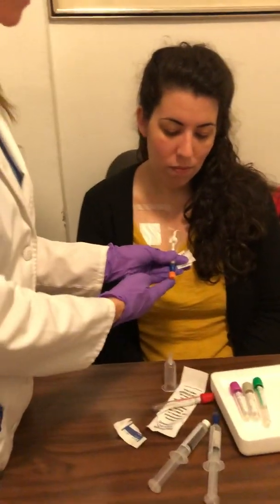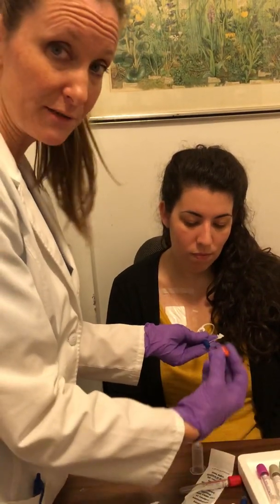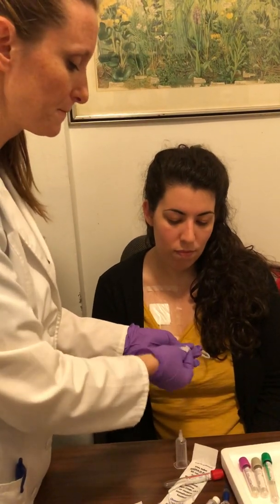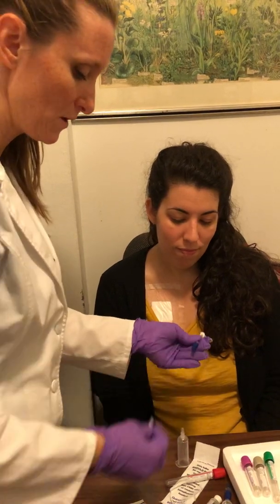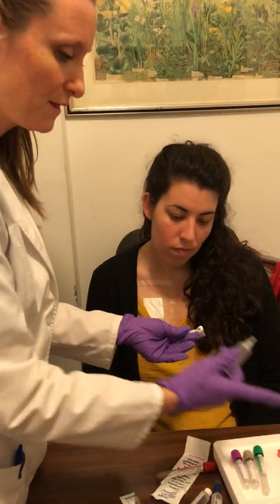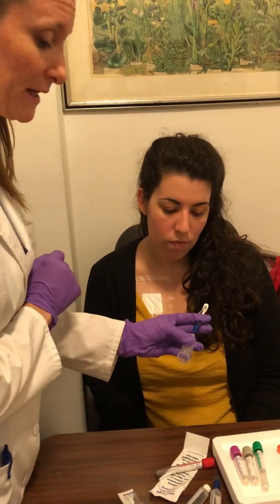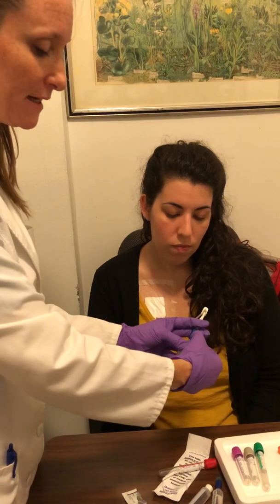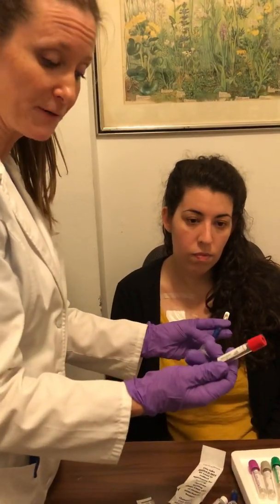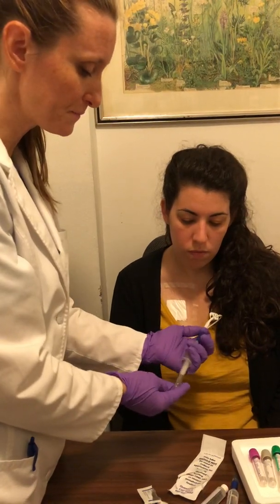Wipe the end of the tube with alcohol. She has a cap covering the end of the tube that has alcohol in it — you can buy these to keep the end of your tube continuously in alcohol, but you don't have to use them. Wipe the end very well; even though it was sitting in alcohol, wipe it again and make sure you get into the grooves. Then unclamp your tube and with the butterfly needleless system, insert this into the end and hold it in place — there's a little plastic piece that keeps pressure so blood doesn't come out when you unclamp.